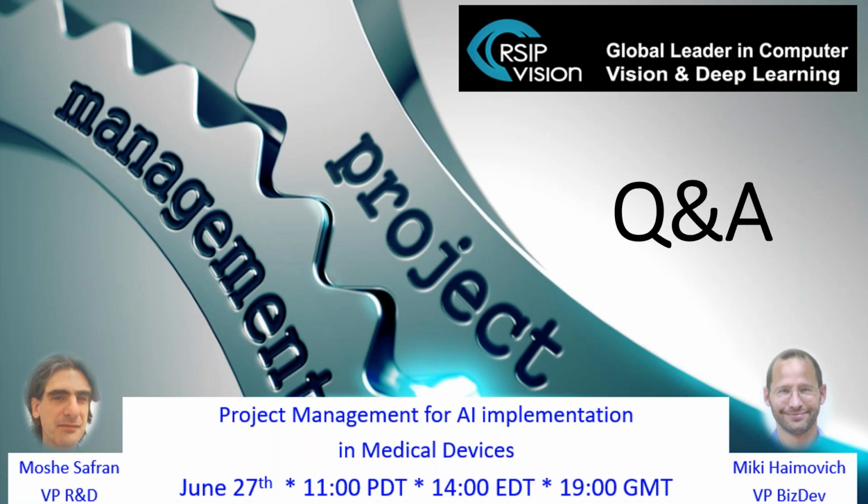Usually, once that happens, you have something quick, you have something that can already be helpful, you can deploy it, and once it's out there as part of your medical device, it gives you more time to collect more and more samples, which enable you to then deal with version 2 and version 3 and so on and so forth.